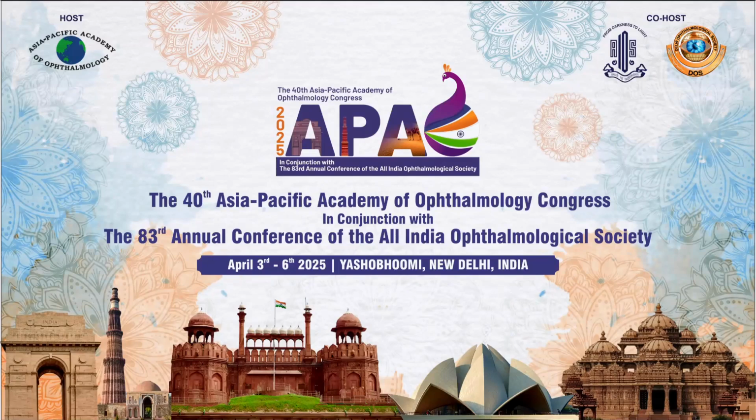So today, this is the last talk of today's session, and it deals with visual field progression. So what is visual field progression?